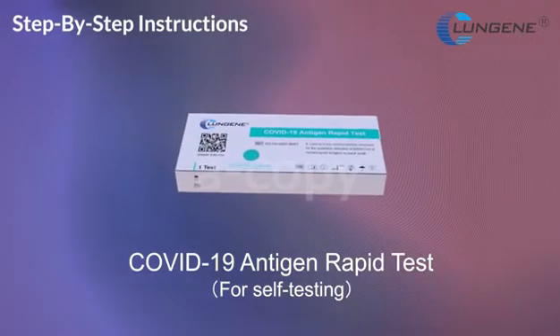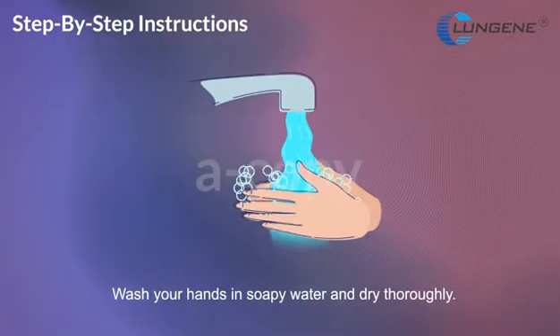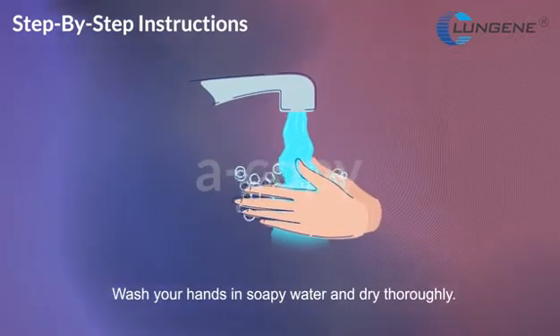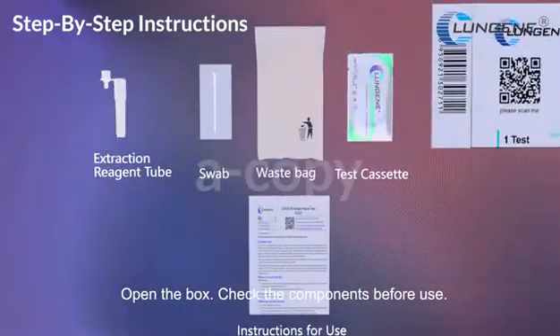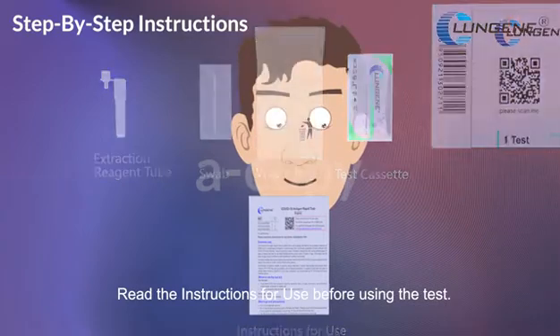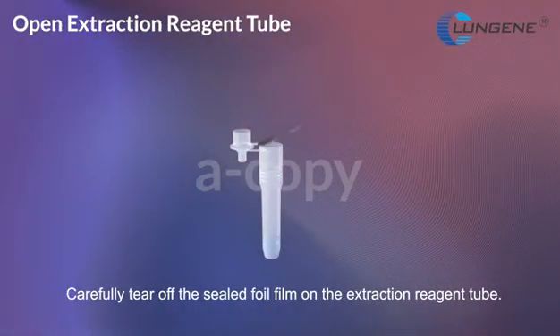COVID-19 Antigen Rapid Test Self-Testing. Wash your hands in soapy water and dry thoroughly. Open the box. Check the components before use. Read the instructions for use before using the test. Carefully tear off the sealed foil film on extraction reagent tube.